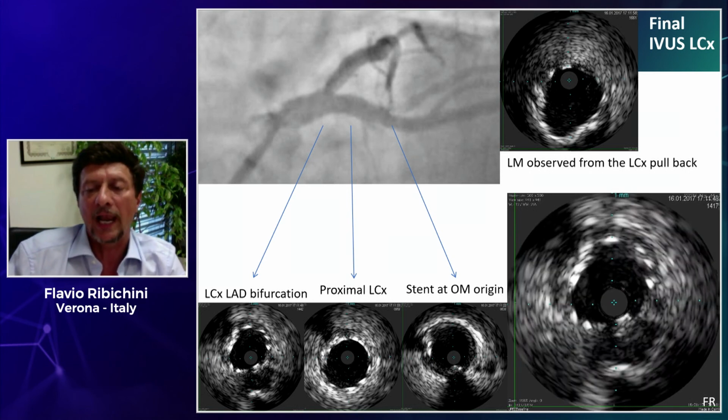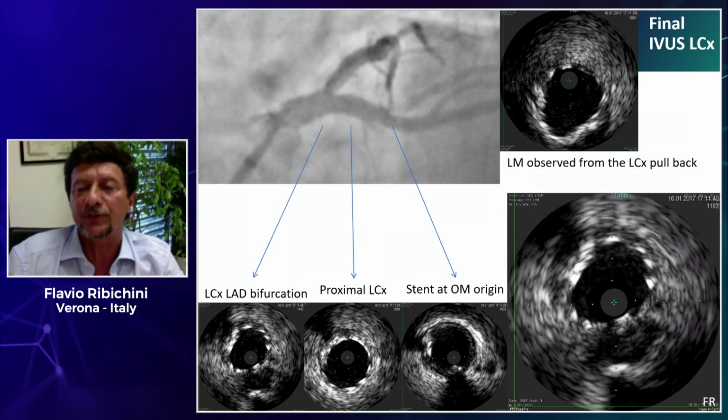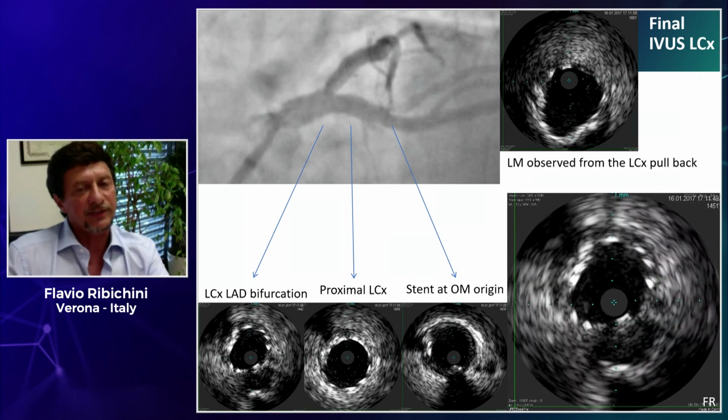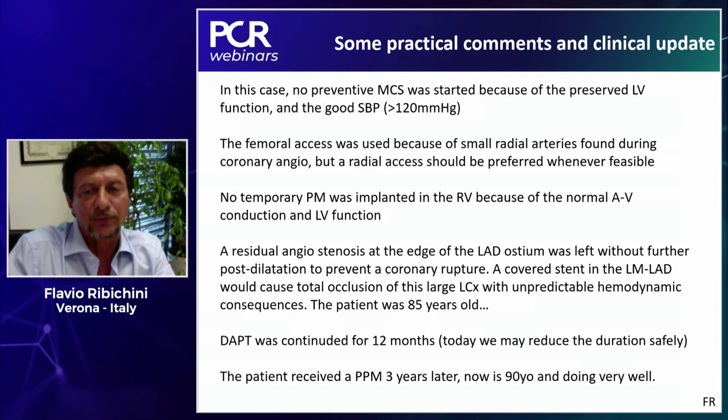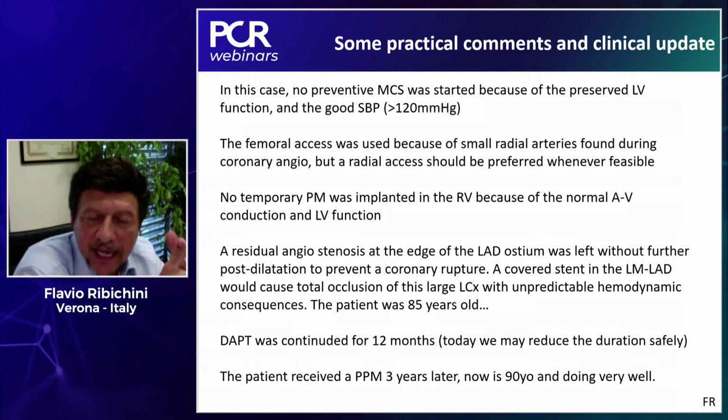You see it now live in this part with flow in the 2 vessels and a well-preserved area on the left main. So I think the case is done. And we can go to practical comments, and we have 5 minutes to add anything else or to address eventual questions from our colleagues.